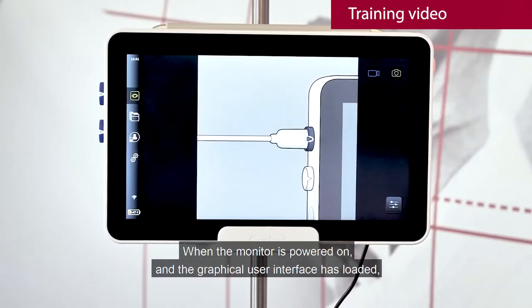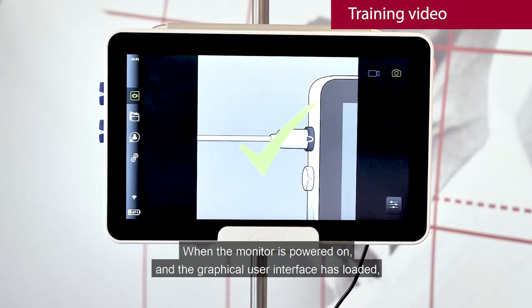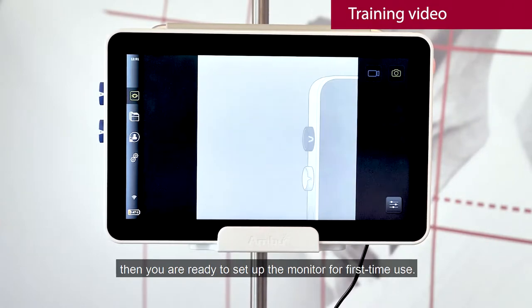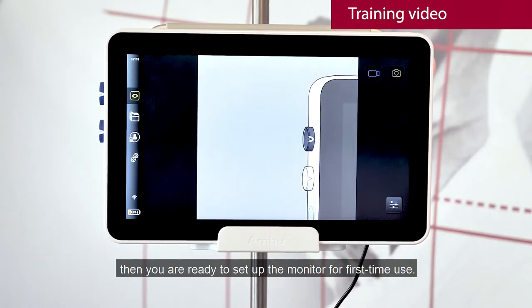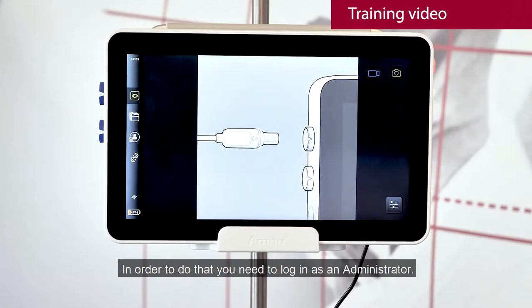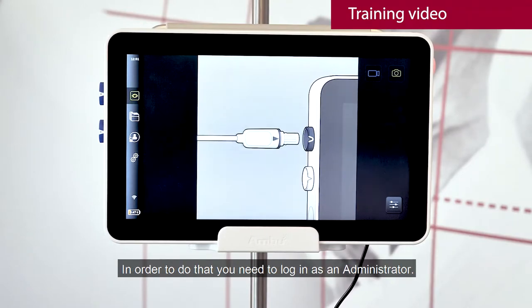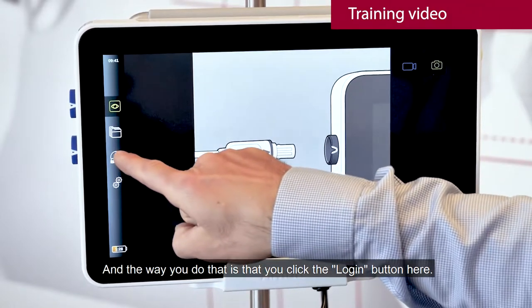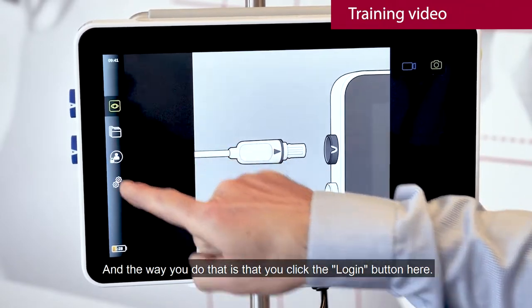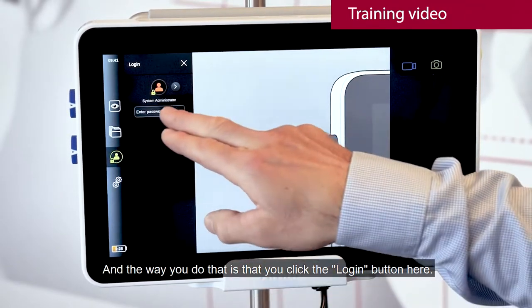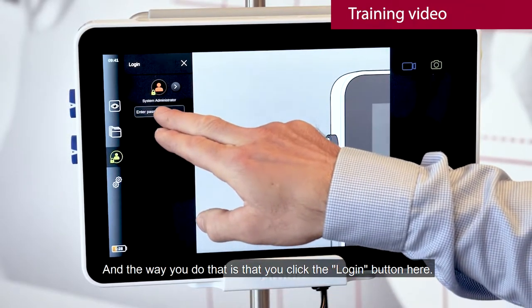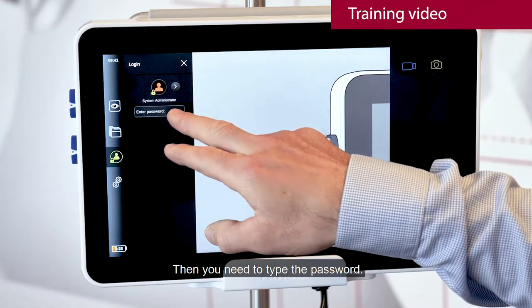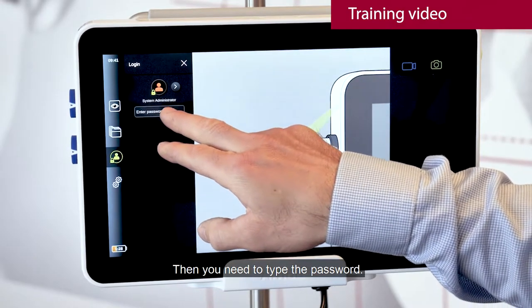When the monitor is powered on and the graphical user interface has loaded, you're ready to set up the monitor for first-time use. In order to do that, you need to log in as an administrator. You click the login button here and then type in the password.